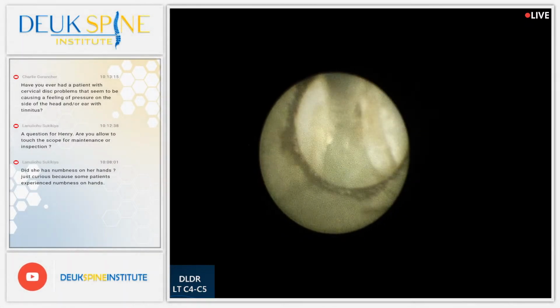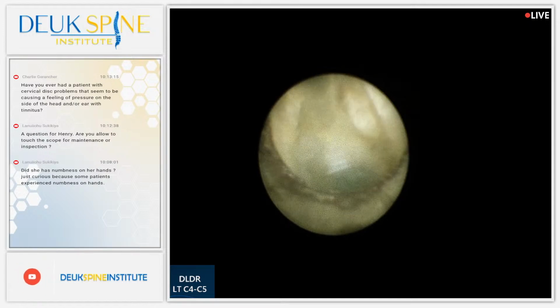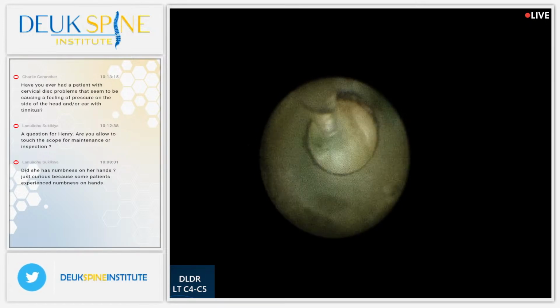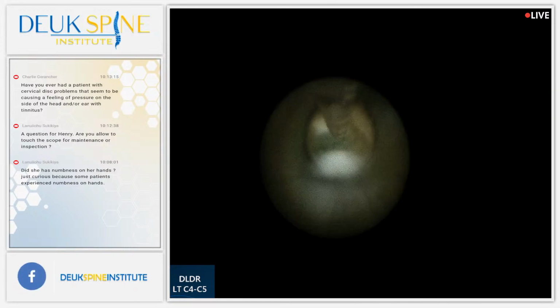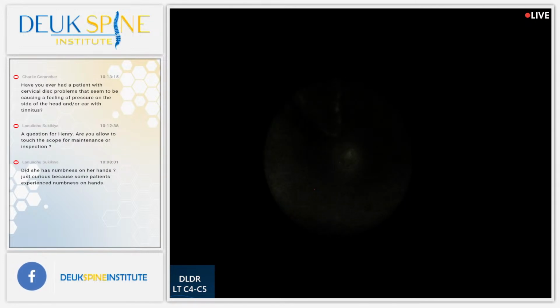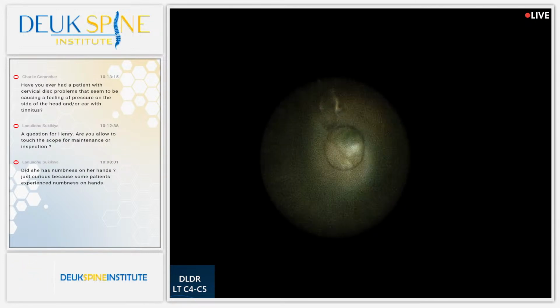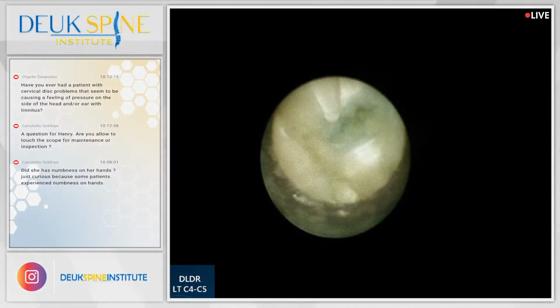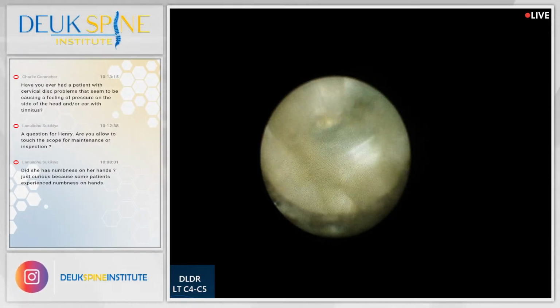Yeah. This is a much more difficult surgery than our typical cervical herniation. Our typical cervical herniation is not as big, it's small. But I've got to go through that hole right there to get to the herniation. I got to make the hole wider, all right? Because you're not going to get the herniation out without making that hole a little bit wider. So let's go to it.